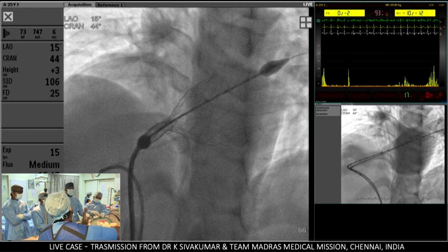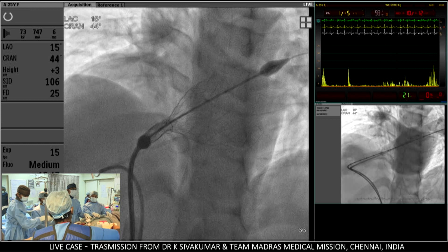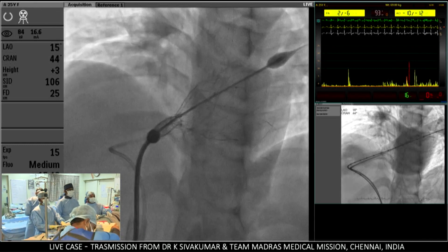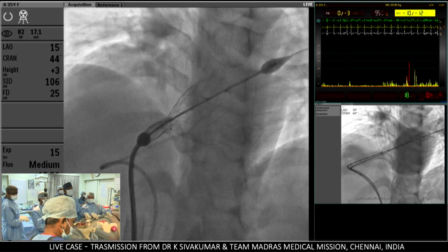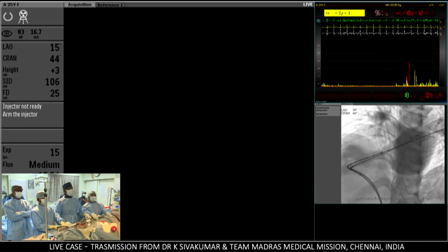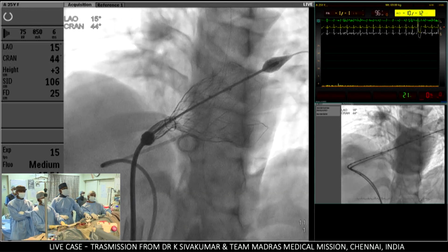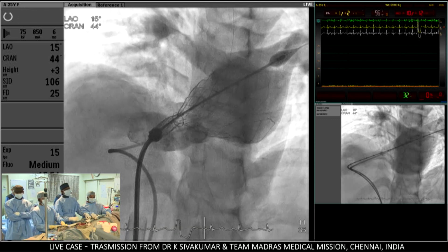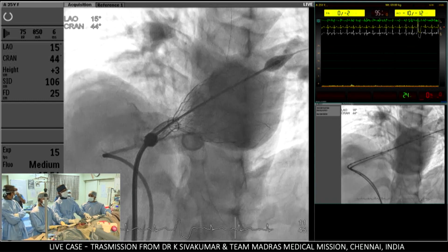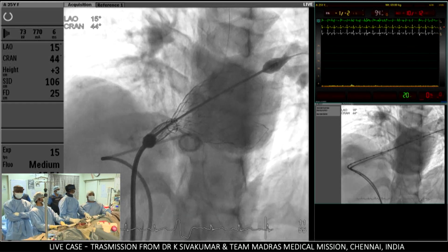Yeah, set 25 ml at 18 rate. Ready? What do you say, Varakan? I think you cannot pull back more, because it's catching the waist now. And the blood pressure perhaps maybe a little bit compromised.